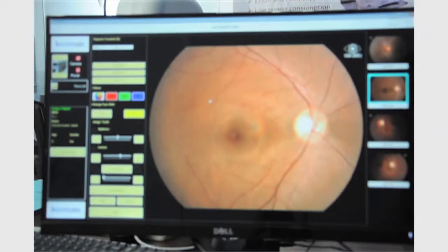There is also a zoom magnifier option available in the software in case you want to find small lesions and show the same to the patient. To enable this, right click anywhere on the image and you can navigate around the entire image. To increase the magnification factor, use the scroll button on the mouse up or down, and to exit, right click again. Another way to access this would be using the zoom magnifier button here. Click on the button and navigate anywhere on the image.